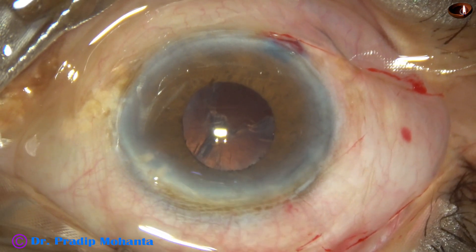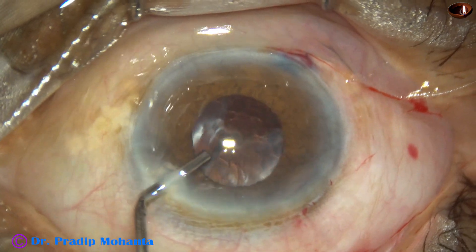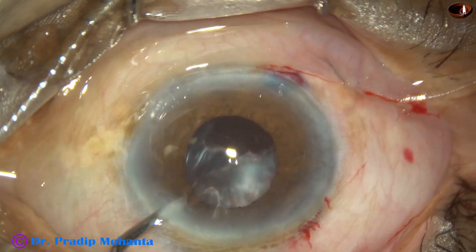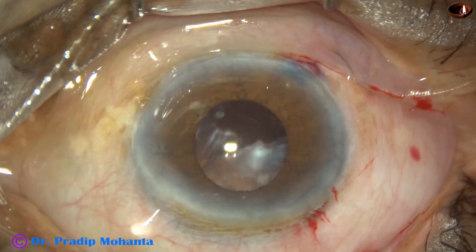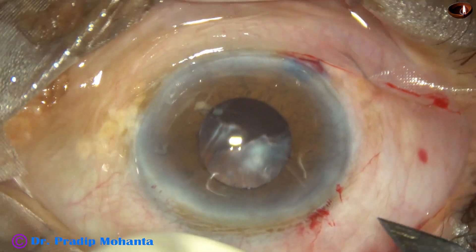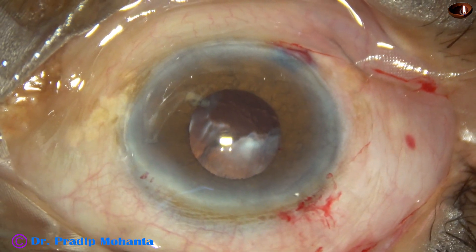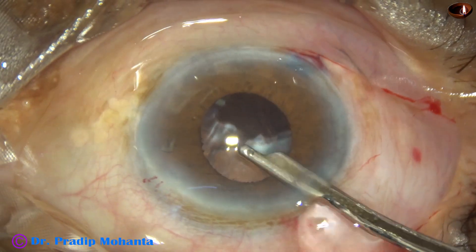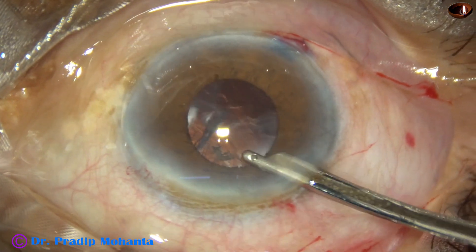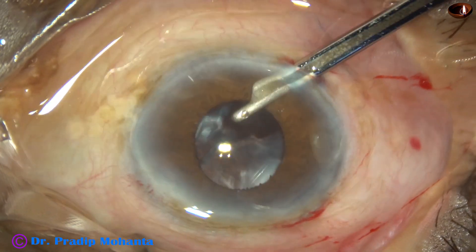There are some small nuclear bits at the side port at around 2 o'clock and those have to be removed. In this case, I am going to use a B cartridge, so I enlarge the main wound a little bit so the 2.8 mm wound becomes about 3 mm. Now the small nuclear bits can come out easily by irrigation pressure.